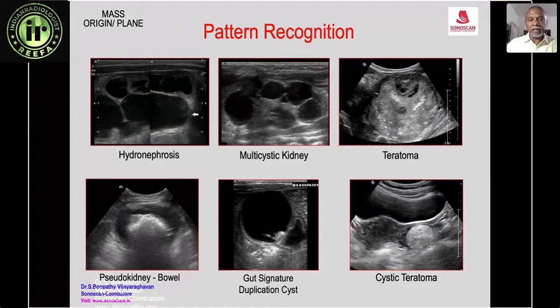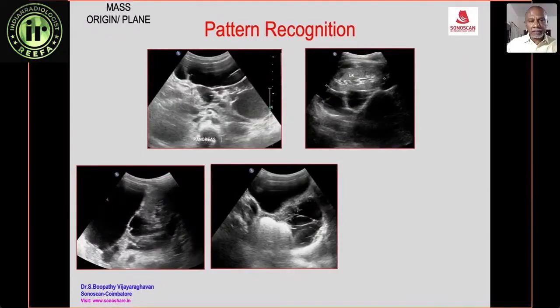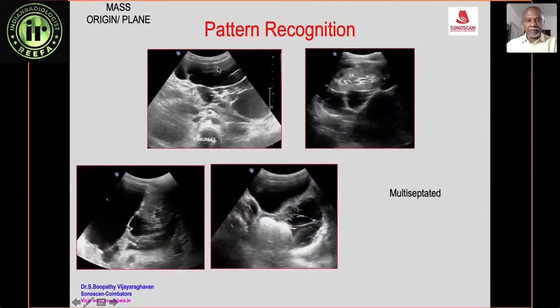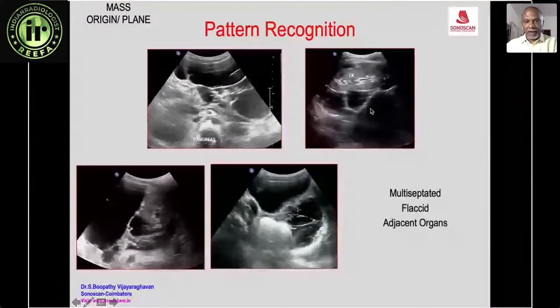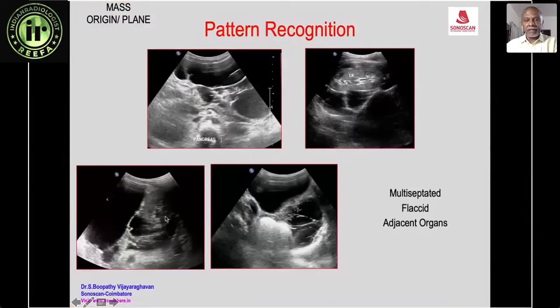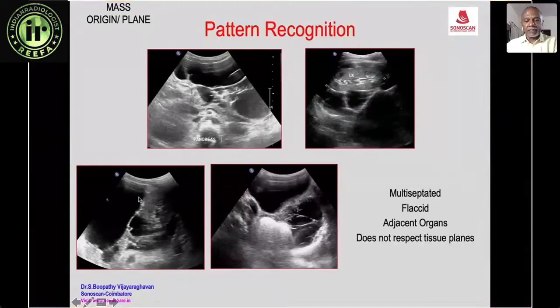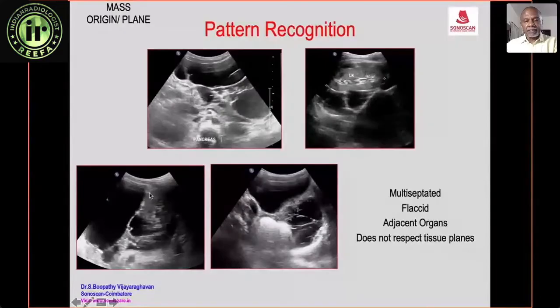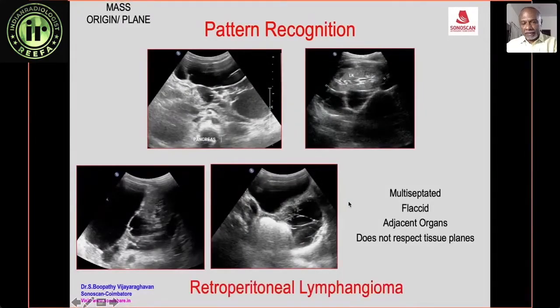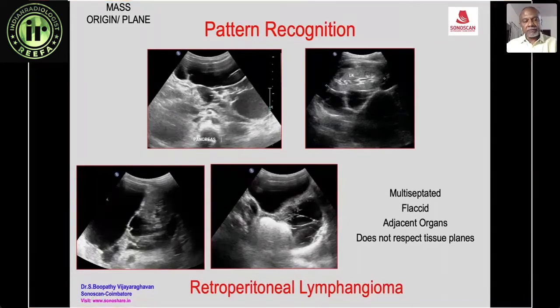Here are four images of a multiloculated cyst that is compressible and flaccid, with no effect on adjacent organs. It goes around structures with acute angles, not respecting tissue planes. You can see it wrapping around the colon. This is the typical appearance of a retroperitoneal lymphangioma — again, pattern recognition.